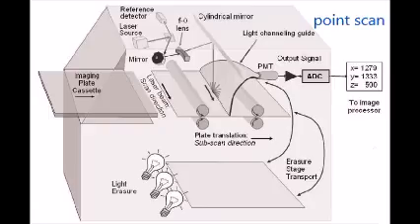With the point scan reader, the IP is removed from the cassette and placed on the transport unit for scanning. The movement of the IP is referred to as the slow scan direction, and the laser beam movement across the IP is called the fast scan direction. The laser beam is used to stimulate the trapped electrons in the exposed IP. Current CR readers use a solid-state laser diode that emits a red laser beam having specific wavelengths.